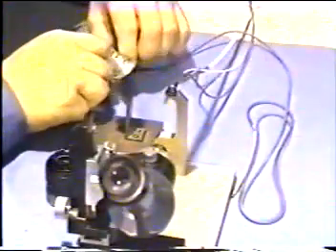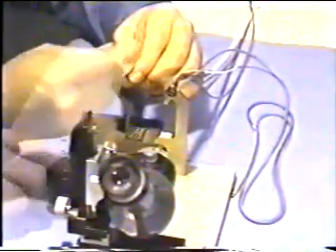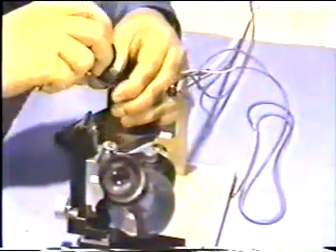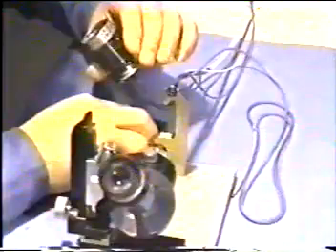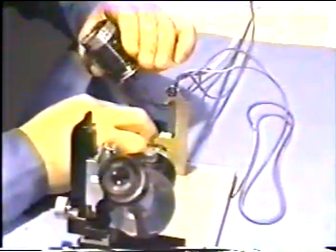Focusing adjustment. Set DTA, distal end tip assembly, on fixing tool. Attach the IG to the eyepiece stand J60064. Adjust diopter range of J60064.